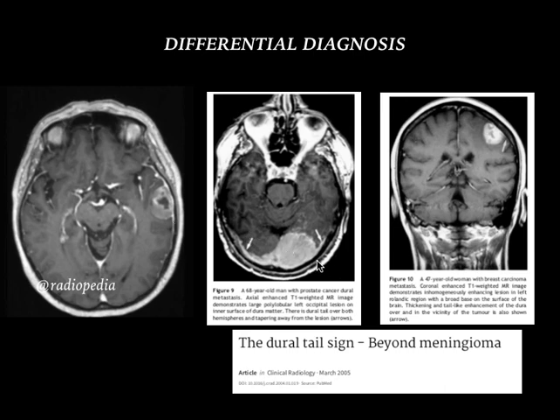This is another case of a known case of prostate carcinoma in a 68-year-old patient. You can see the large enhancing lesion with adjacent irregular dural thickening, proven to be dural metastasis. This is a 47-year-old female patient with breast carcinoma. You can see a small dural thickening — this is actually an intra-axial lesion with adjacent dural thickening, proven to be metastasis from breast carcinoma.